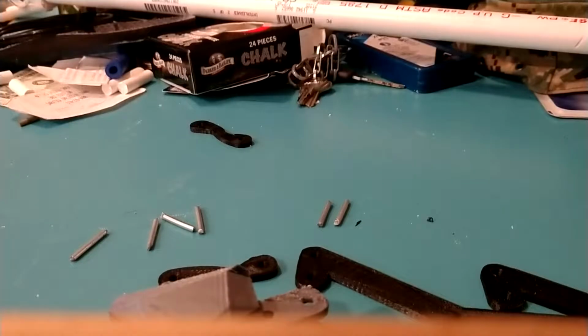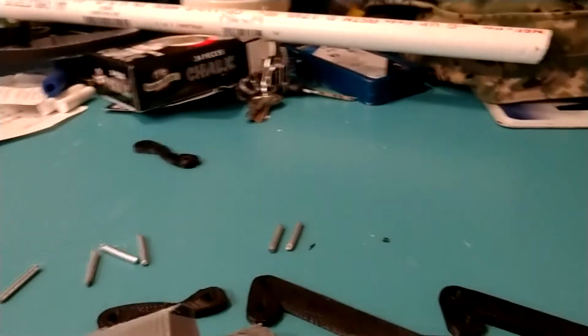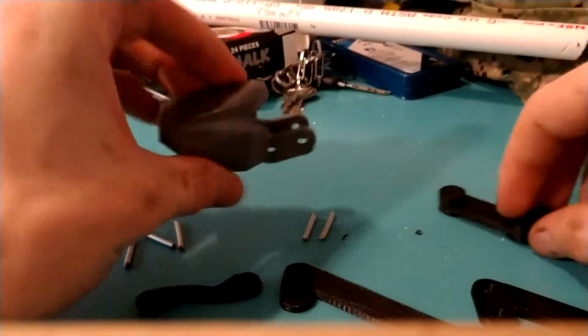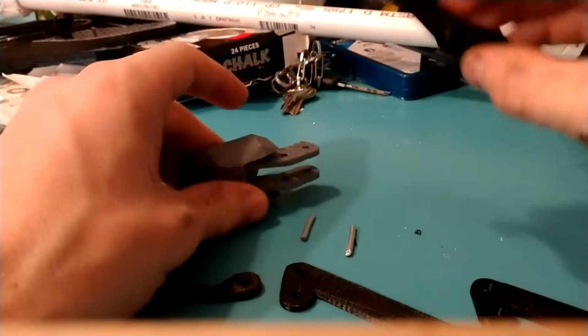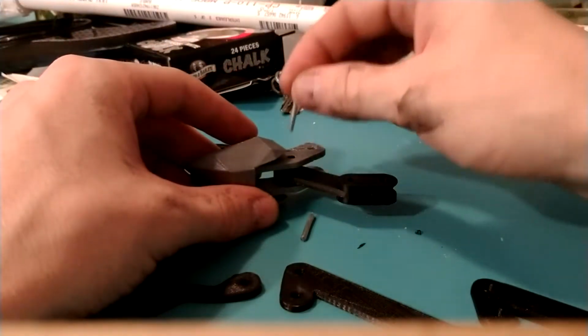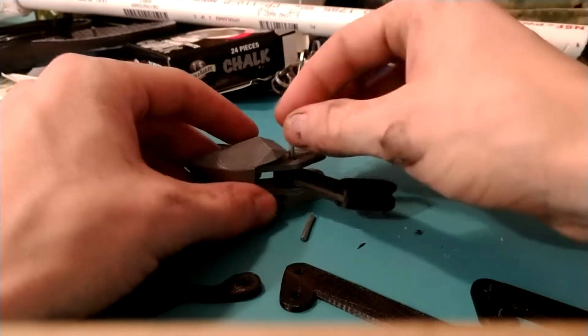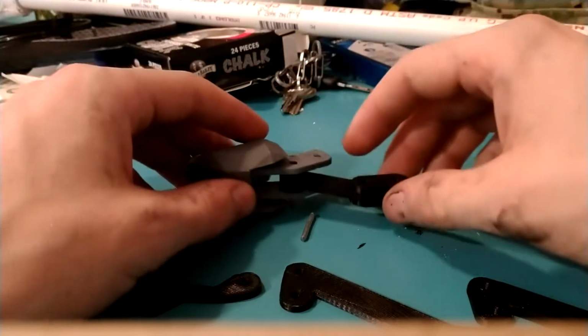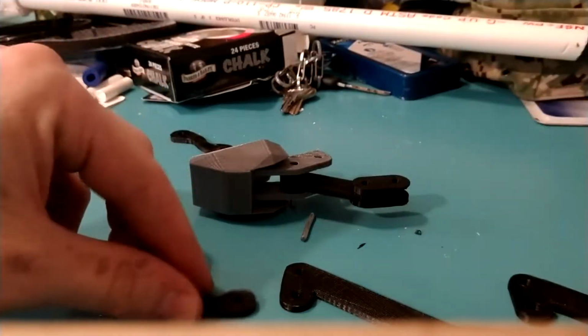Alright, so this is how the linkage system goes together. The fingertip is part of the linkage system. This is one of the bars you're going to need. I'm using these temporary pins just to illustrate. I'm not going to glue these in quite yet. Still need to print some other things.